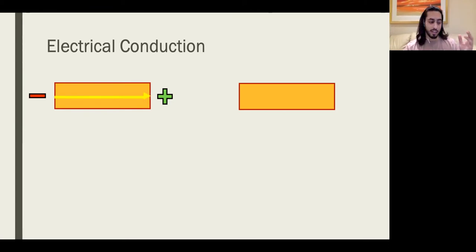If the action potential or the actual energy is going towards the positive electrode, then what you'll get is a positive deflection on the ECG. That's all you need to understand. So electrodes can pick up positive deflections, meaning the energy and action potential is going towards them. Negative deflections, meaning the action potential is going away from them. Or they can be flat lines, or what we call isoelectric, when the action potential is actually perpendicular to them.